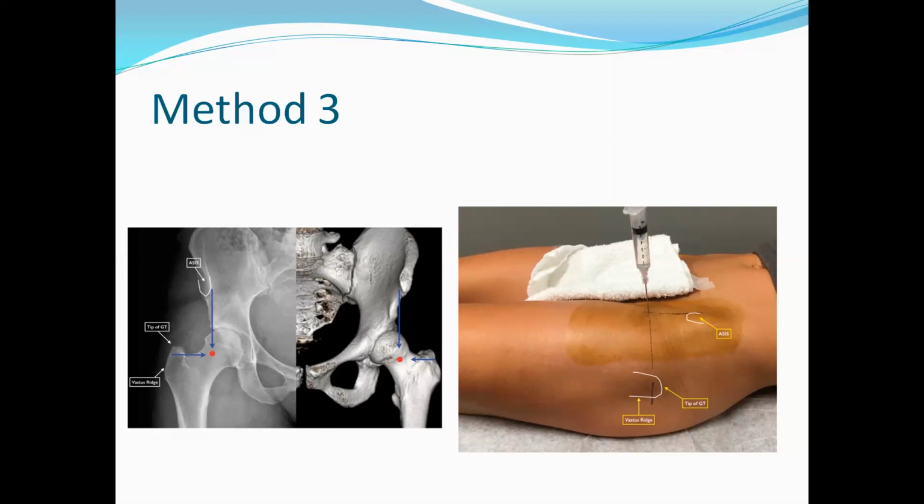Take care that you are far away from the femoral artery. You know, the arrangement is vein, artery, nerve from medial to lateral. So the nerve is the lateral most, and the vein is the medial most. So you palpate the femoral artery. It should not come in the way of your syringe or entry point. Certainly, if you take the landmarks, you will not encounter any femoral vessel through the entry portal.